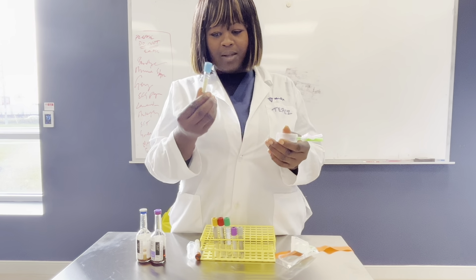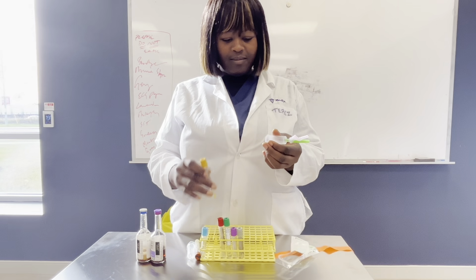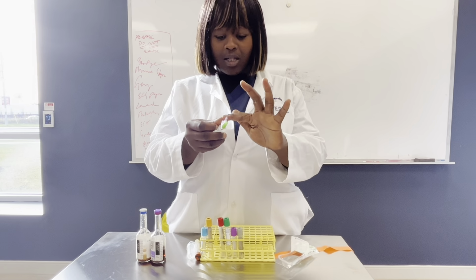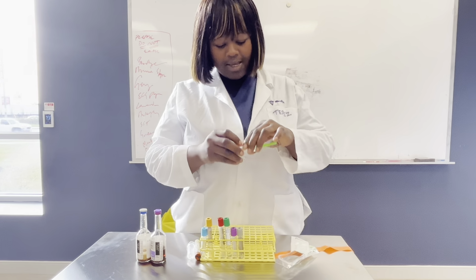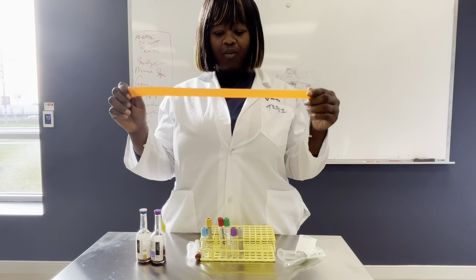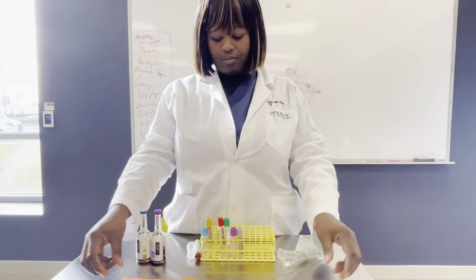This tube has a vacuum. So from the moment you enter this, it's going to suck the blood. Just keep removing, and that's that. When you're done, you discard this. This flips back over, locks the needle in place, and then you throw this in your sharps container. And that's that. And this little thing here is, my friend, the tourniquet. You put this on before you start the venipuncture because this makes the vein more accessible.